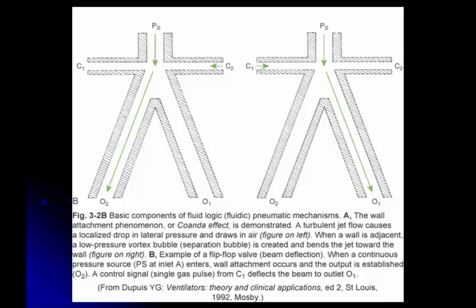I don't want gas flow to go to the patient, which would be outlet 1. I only want it through outlet 2. Then I want to turn the breath on, so all of a sudden I create a oxygen or a flow at C1, pushes it the opposite direction, and continues out to the patient. When I want to turn it off, I just open up the C2 spigot again. So I'm using it to go back and forth. Flip-flop. That's what the type of device is called.